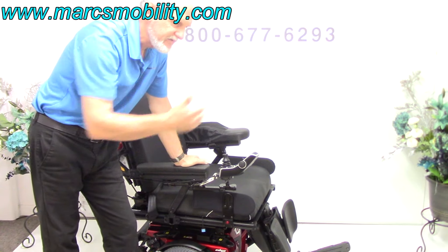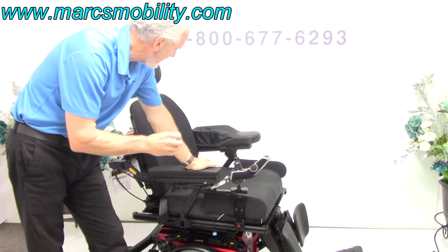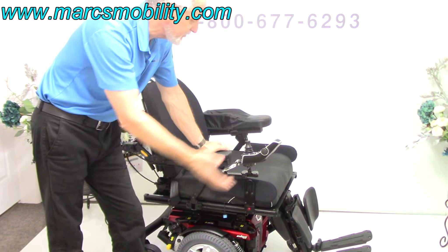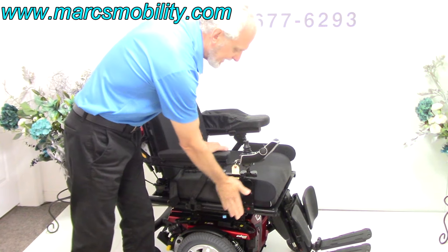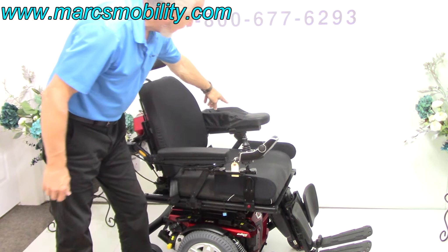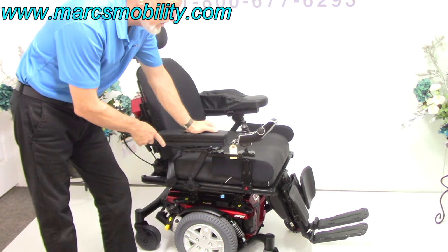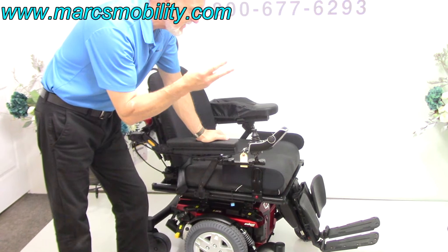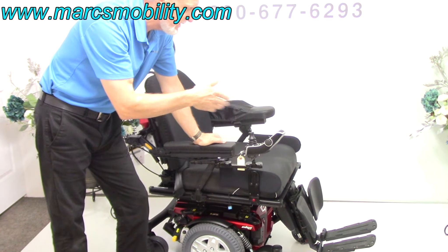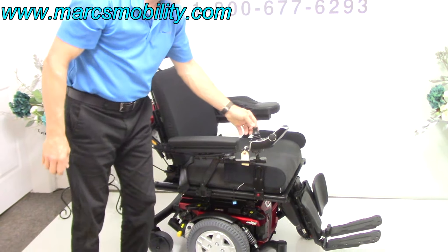To recap: this is the Quantum Q6 Edge 2.0 HD with electric tilt, electric recline, electric legs, swing-away joystick, lateral pad, flip-up arms, reinforced arm bars, custom arm pad, safety belt, a very nice cushion, and solid tires with heavy-duty motors. This chair has approximately one mile on it and is in new condition, ready to go.